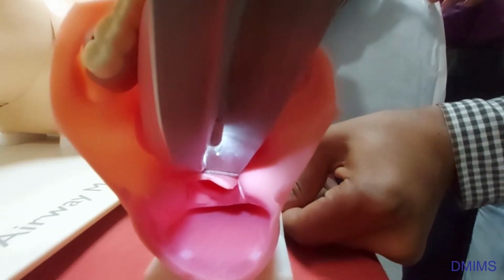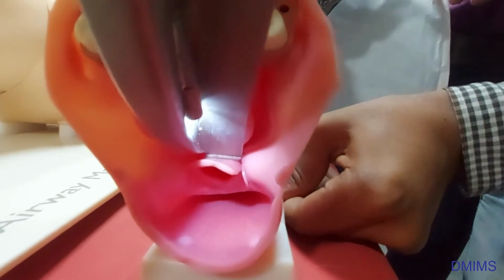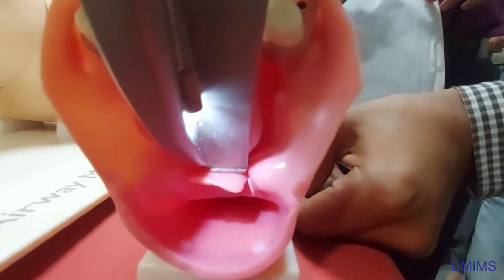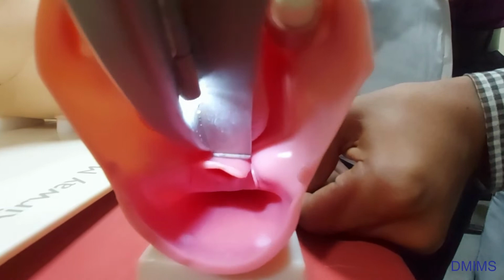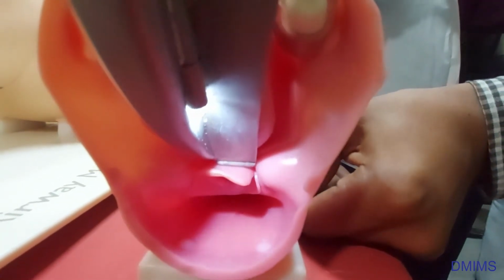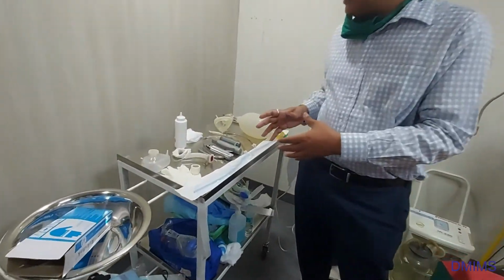The vallecula is the junction between the base of the tongue and the epiglottis. You can see the epiglottis, this flap-like, rhomboid structure. As you can see, when I am pressing over the base of the tongue, there is movement of the epiglottis.